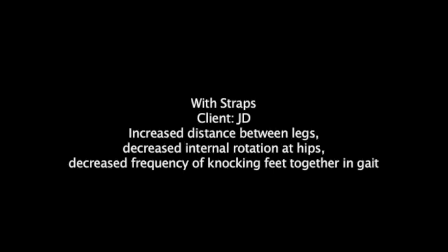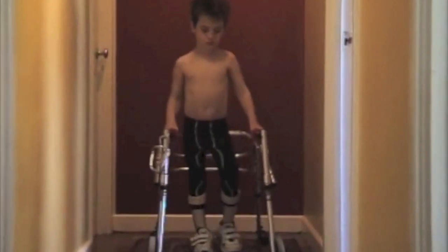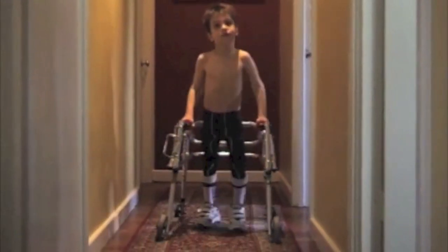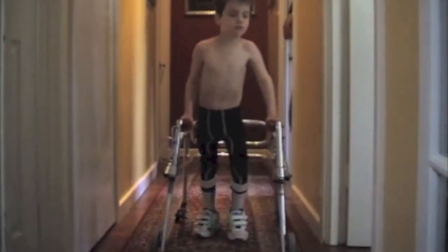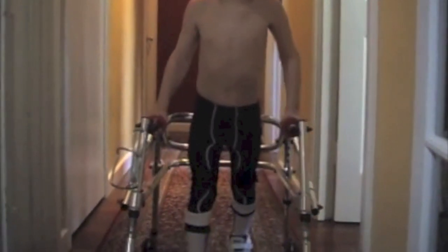With the brace in situ, there is a significant difference in JD's walking style. As you can see, the legs are more separated, the hips are rotated in a more externally rotated position, reducing the knock knee effect. There is a reduced incidence of knocking of the feet together and he is clearing the ground more competently with walking.